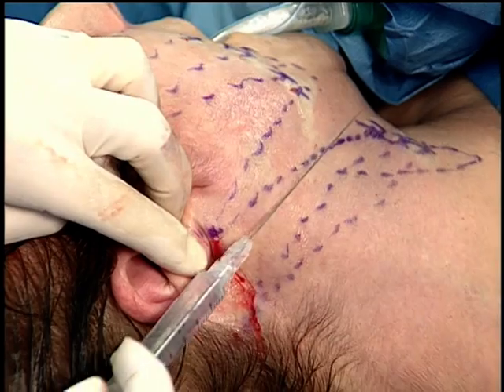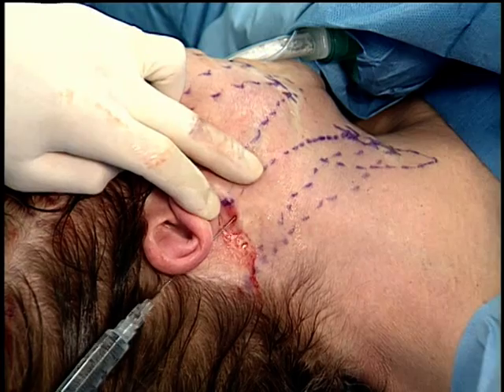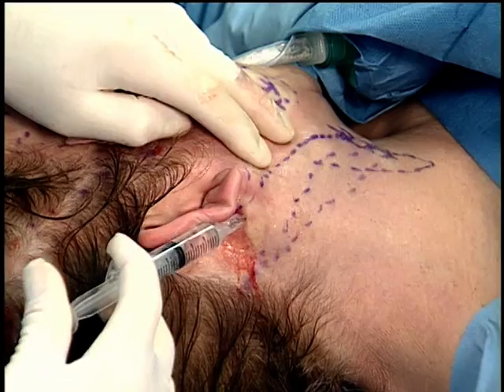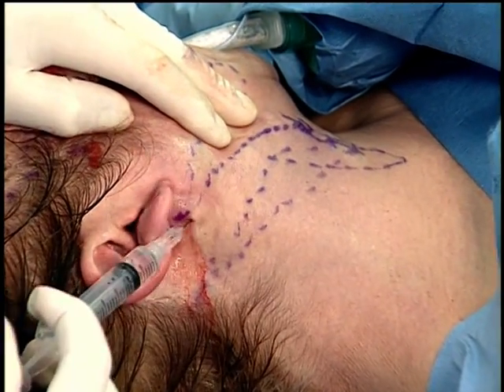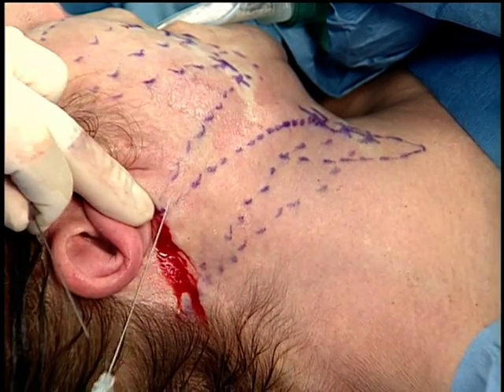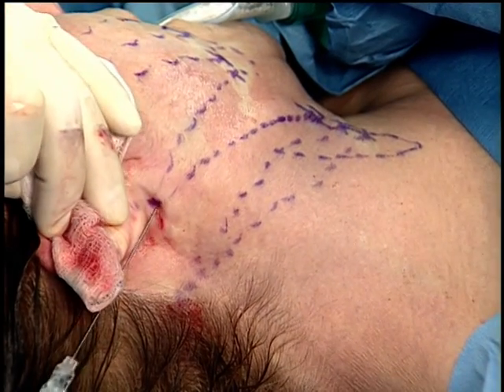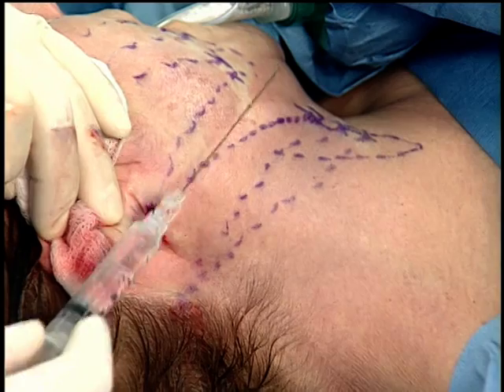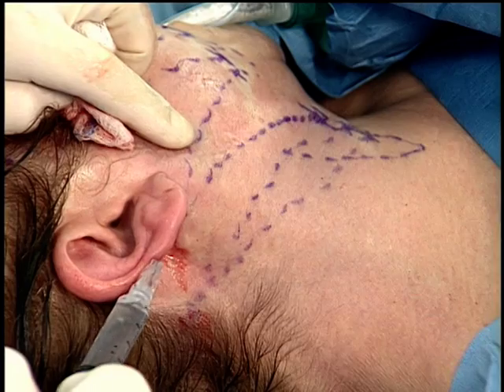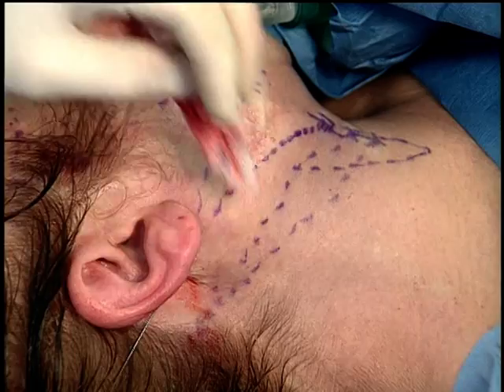Go under our lobule again. This time we're going to do below the jawline. Get into the subcutaneous fat above platysma. Infiltrate, hydrodissect on the way, slowly advance, get down to your exit point, and then inject your 2.5 cc's on the way back. I want to connect between the two so I can dissect aggressively over the mandible to really define the jawline border. So I'm going to infiltrate in this region right here. Little tumescent anesthesia above platysma and SMAS. Get in the right plane, slowly hydrodissect, and pull back and inject.